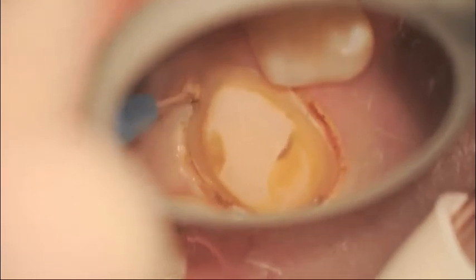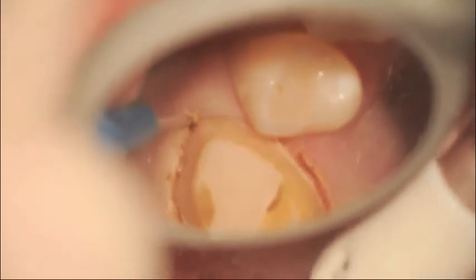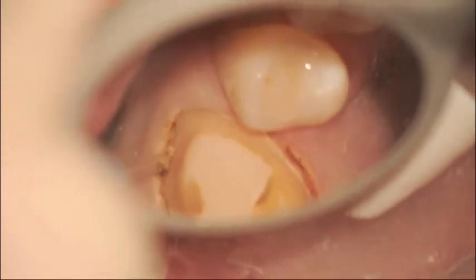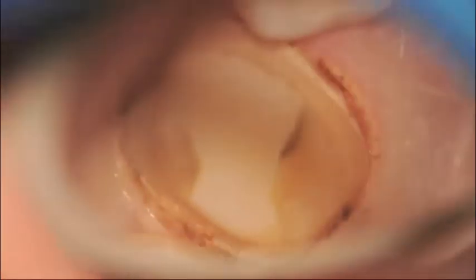We're now on the facial aspect of the tooth, looking through the operating microscope at around 5.3 times magnification. As you come to the mesial, the last little bit of the mesial, you'll see me bump up the magnification to 8 times magnification to complete the troughing.